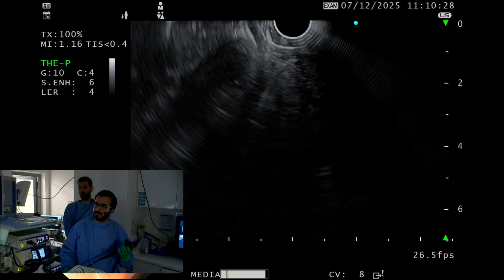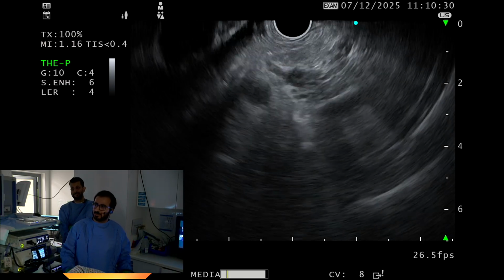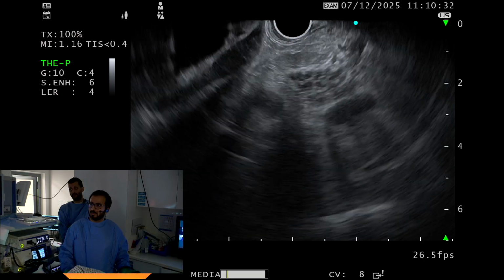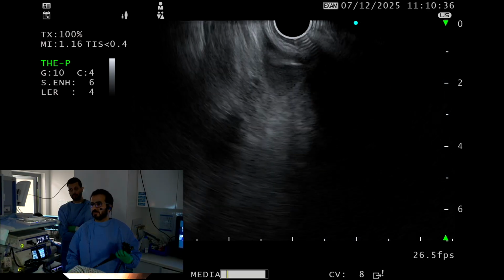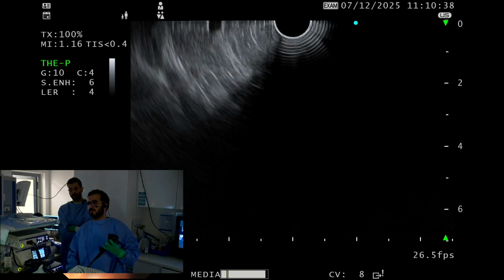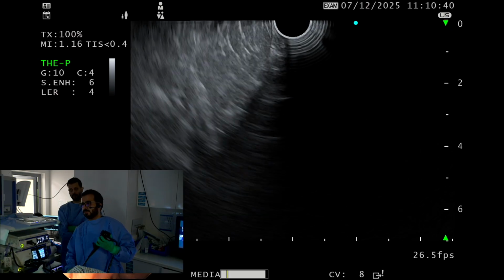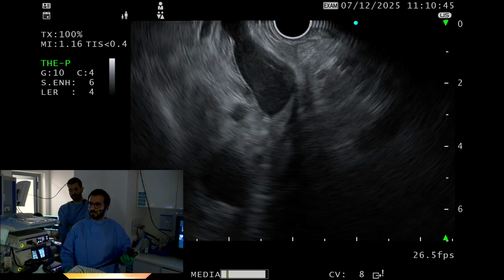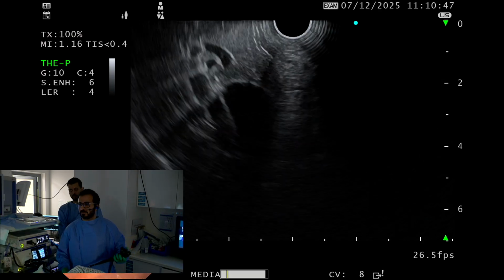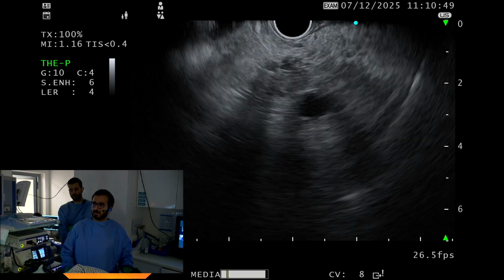So, first of all, what are we dealing with? I think the pancreatic cystic morphology points towards more of a branch duct IPMN. I think the main pancreatic duct is normal caliber. The lesion in the head of the pancreas is likely a multiseptate, branch duct IPMN.